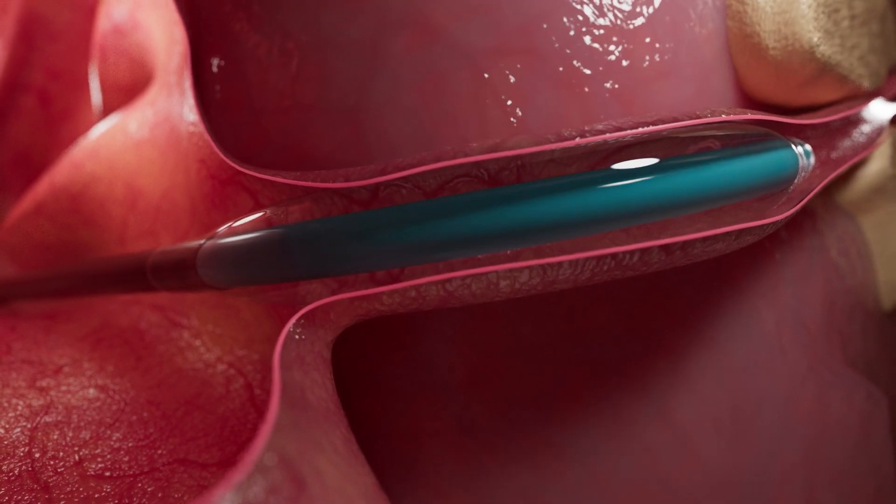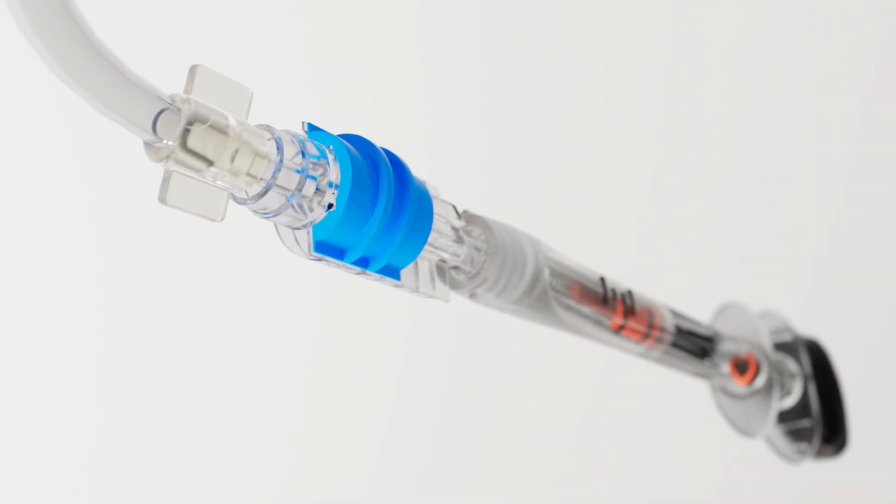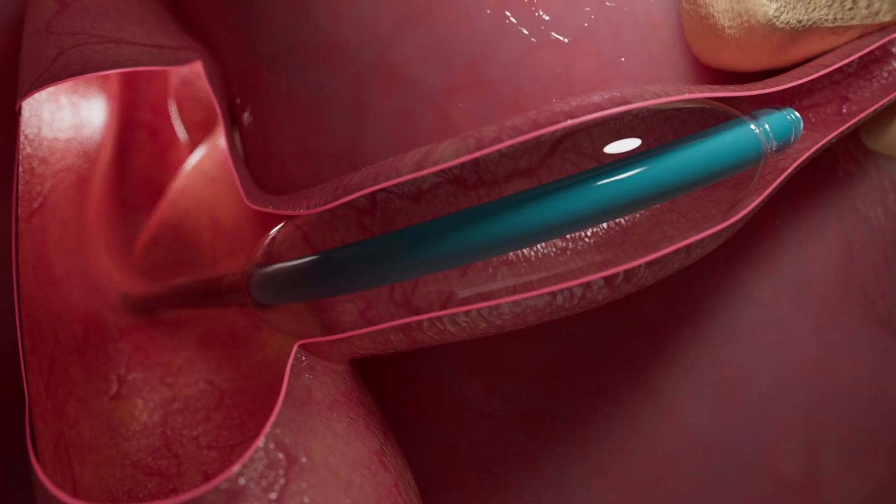To begin the dilation, slowly inflate the balloon, then push the inflation lock forward. This will ensure 12 atmospheres of pressure are maintained for the 2-minute dilation.